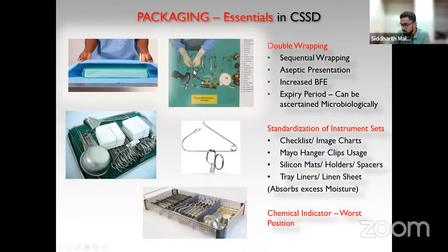This is one of the photographs that I have taken, Rajendra sir, I have taken this photograph of yours where in his own OT, he has ensured that each and every set is indexed and instrument. So if your regular OT technician is not in place and if you want somebody should actually pack a tray properly, he will not miss a single instrument if it is indexed properly.